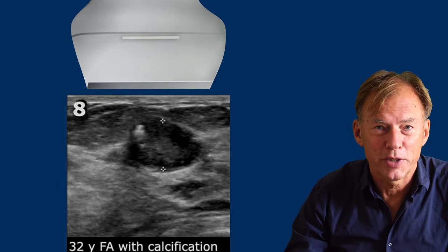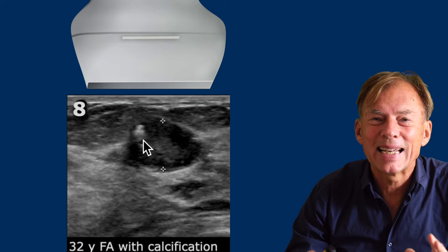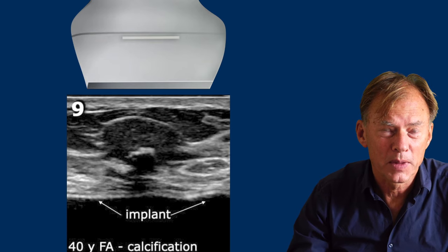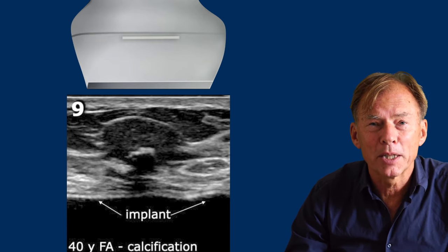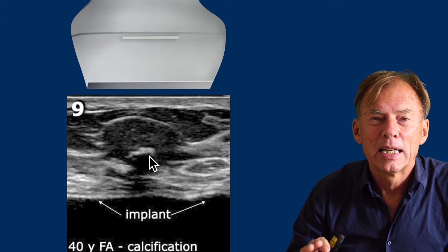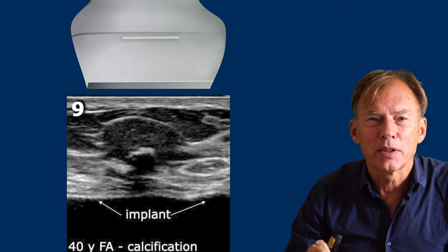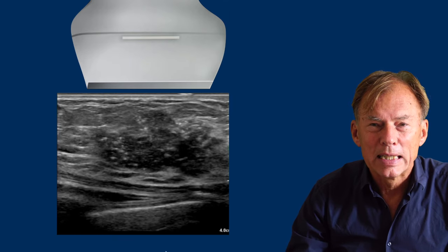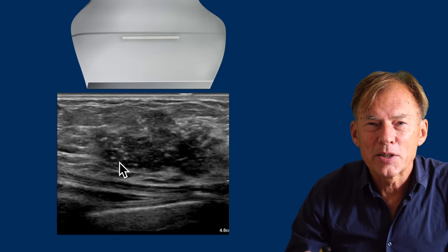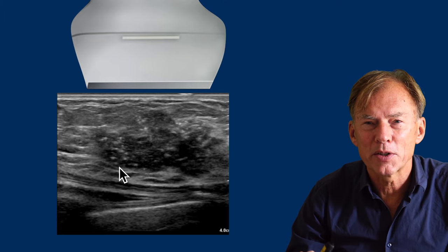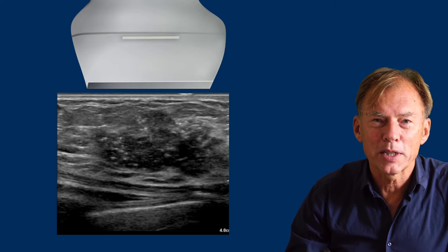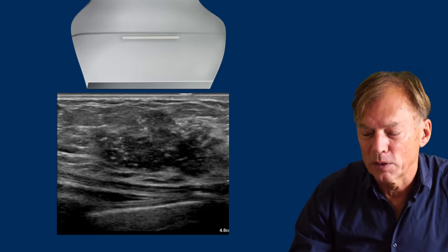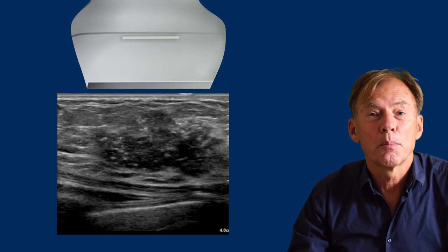Fibroadenomas sometimes have calcifications, but these are larger than the small calcifications we encounter in carcinomas. Here is a typical fibroadenoma with a gross calcification. These calcifications are different from the very tiny microcalcifications seen in breast cancer, which are sometimes not visible on ultrasound but only on a mammogram.